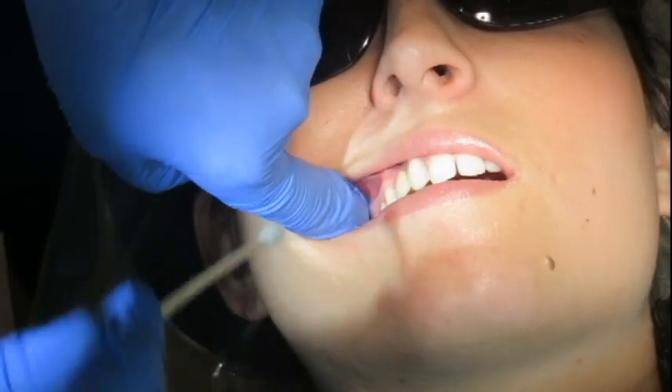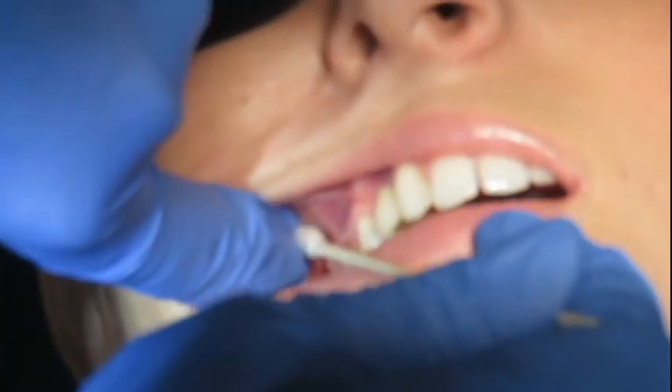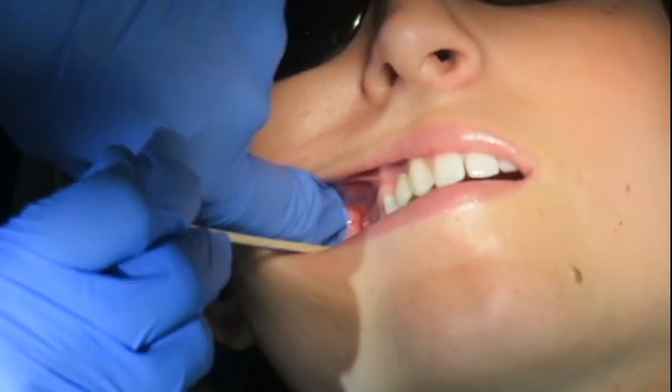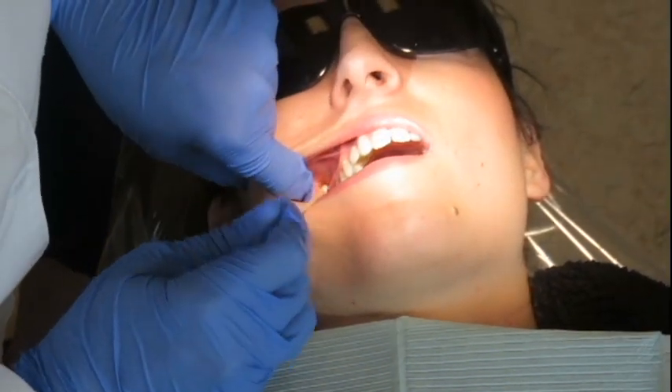Now that we've got the retraction down, we're going to actually give the injection. The site is going to be the middle of the soft spot behind the zygomatic strut. A lot of people use the distal buccal root of the second maxillary molar as their landmark, but remember the roots go a little bit distally, so it's still going to be more distal than that — way back there. The PSA gets the maxillary molars — all three — the pulpal tissues, the overlying periosteum on the facial side, the connective tissue, the mucosa, everything on the facial. It does not get anything on the lingual. It gets all those molars except for possibly the mesial buccal root of the first molar, which is often innervated by the MSA injection.